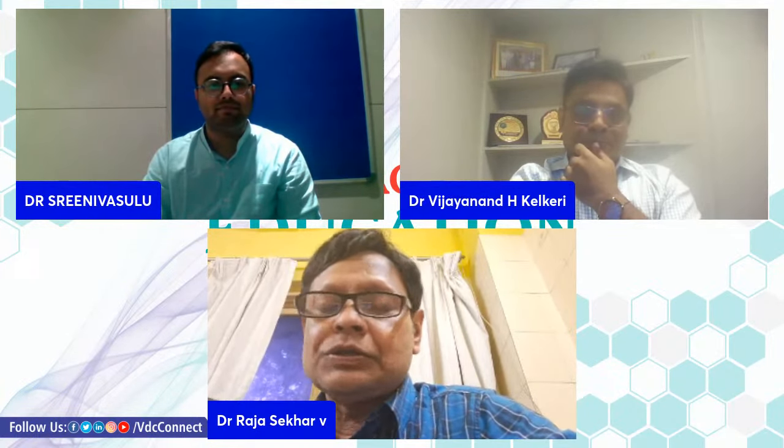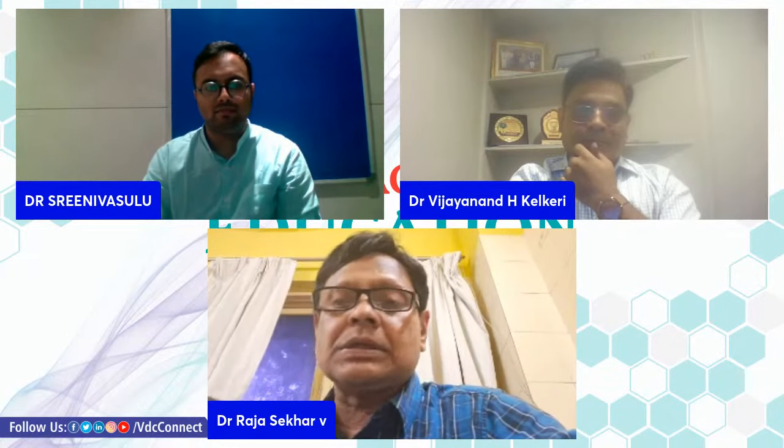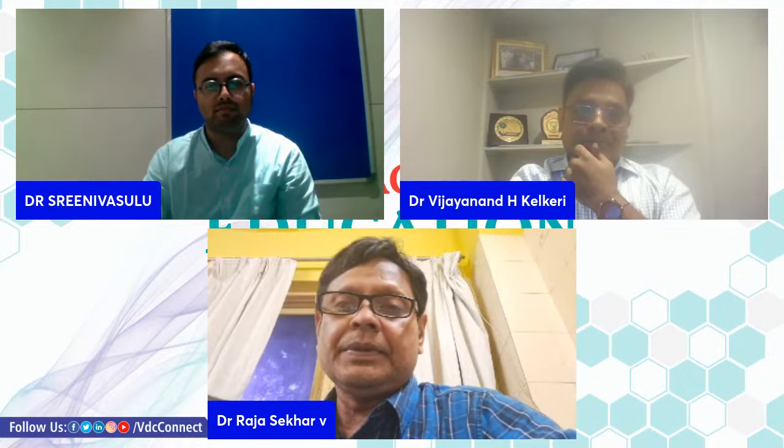True. A surgeon is doing the incision and drainage of the pus, and again it is recurring. Unless you go along the tendon up to the musculotendinous junction, the infection cannot be eradicated. So this is the importance MRI has, one thing.